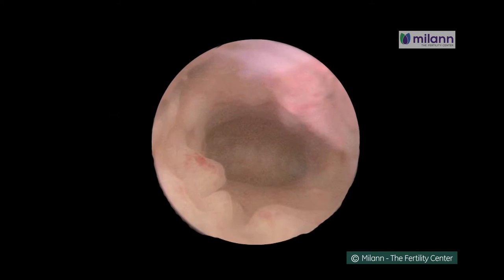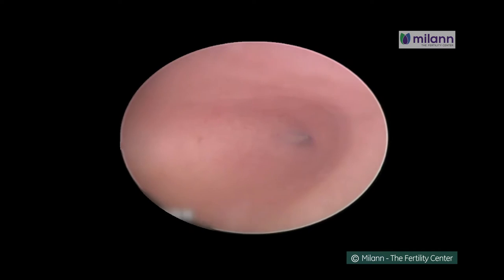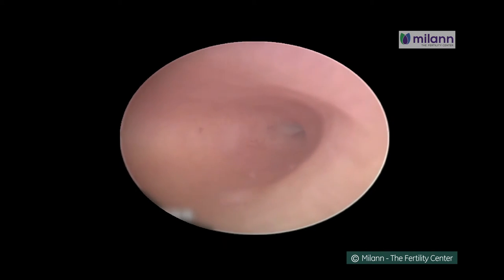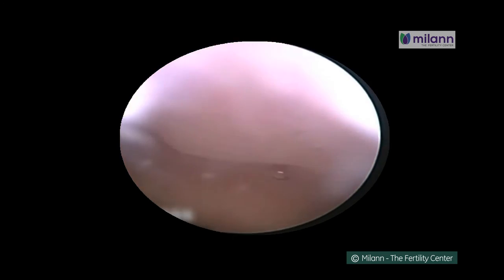These are the conditions where an operative hysteroscopy is mandatory. Your doctor may recommend scheduling the hysteroscopy for the first week after your menstrual period — this timing will provide the doctor with the best view of the inside of your uterus.